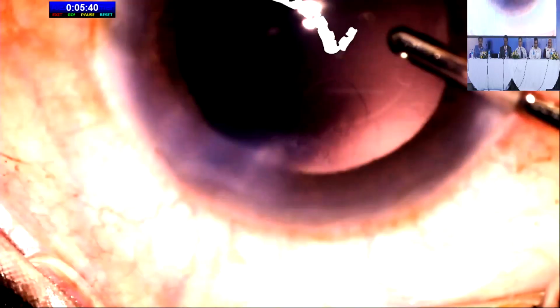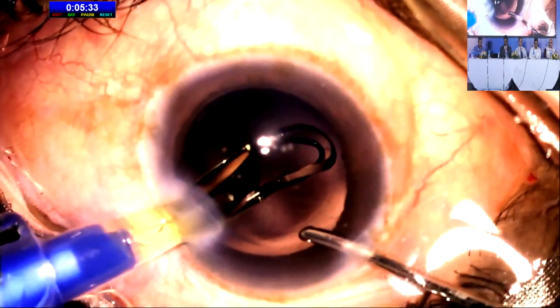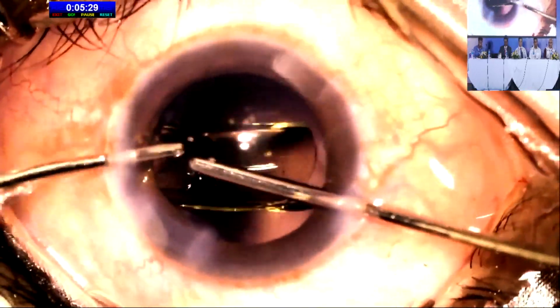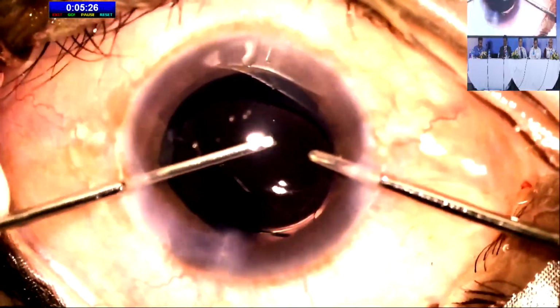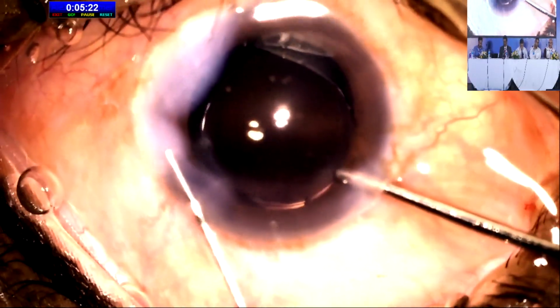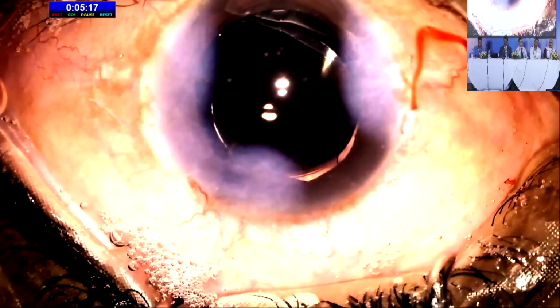Since there is no vitreous disturbance under the irrigation itself, the surgeon then holds on to the tear in the posterior capsule with the help of an intraocular forceps, and this tear, as you can see, is converted into a stable circular opening. We now have a small, circular, stable opening in the posterior capsule and no vitreous disturbance. The surgeon now proceeds to implant a single-piece monofocal IOL within the capsular bag. With the hydration of all the incisions, we now come to the end of this surgery, and this is the end result that we have achieved.